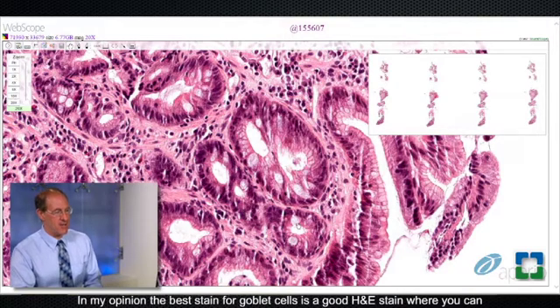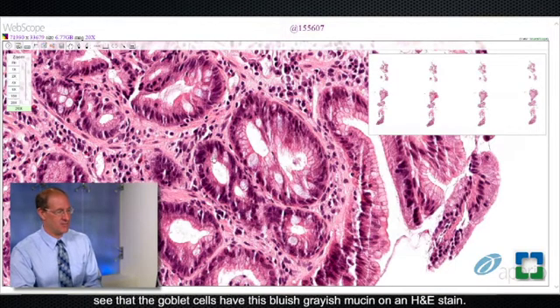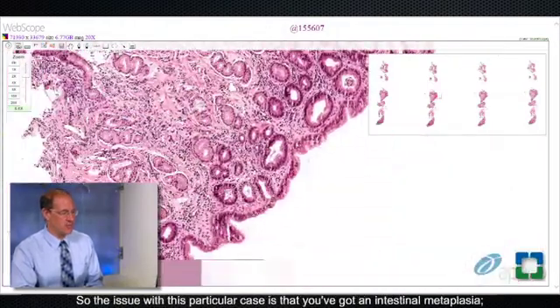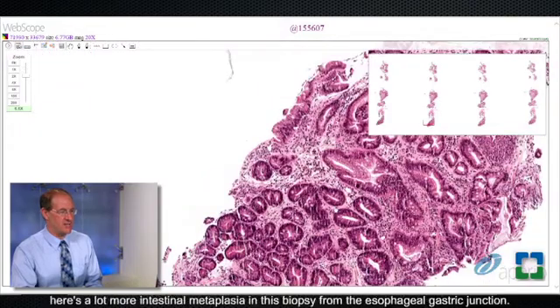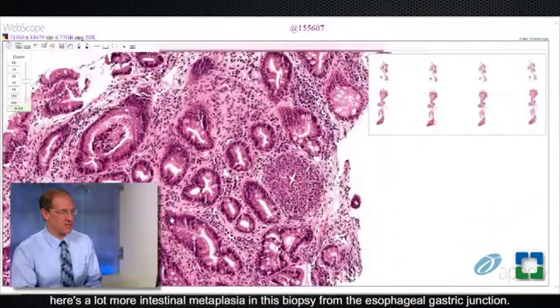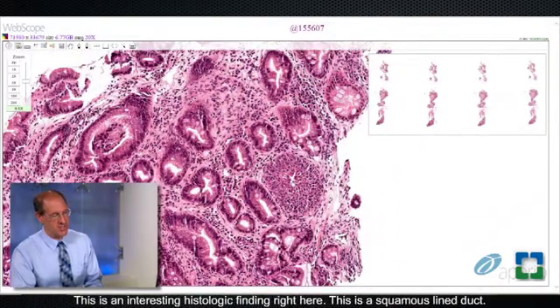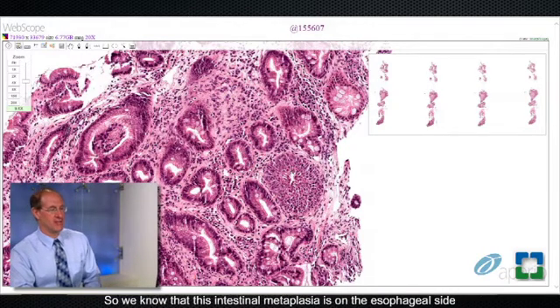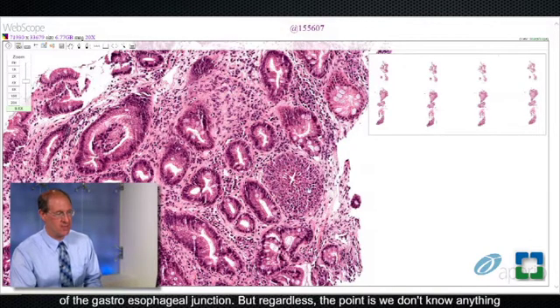Those are goblet cells. In my opinion, the best stain for goblet cells is a good H&E stain, where you can see that the goblet cells have this bluish-grayish mucin. I don't believe you need to do Alcian Blue PAS stain or any other special stain to document the presence of intestinal metaplasia. This biopsy shows a lot of intestinal metaplasia from the esophagogastric junction. There's also an interesting histologic finding — a squamous-lined duct, which is the duct that drains the esophageal submucosal glands, confirming this intestinal metaplasia is on the esophageal side of the gastroesophageal junction.